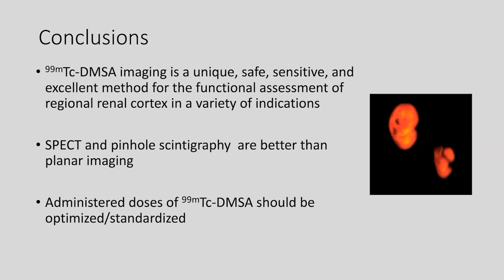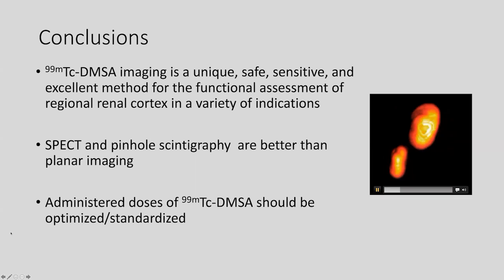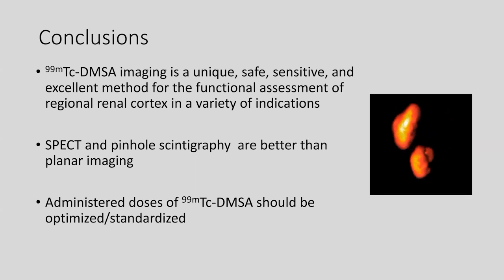The administered doses of DMSA should be optimized and or standardized. As I showed you before, the North American expert consensus guidelines provide administered doses that are reasonable to obtain good studies both in children and adults. These administered dose charts are being optimized constantly.